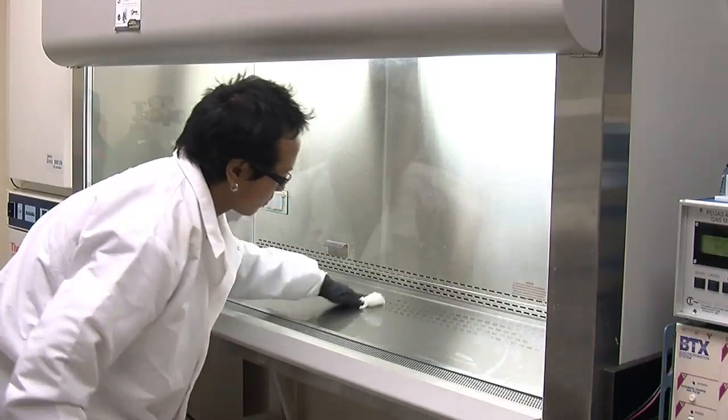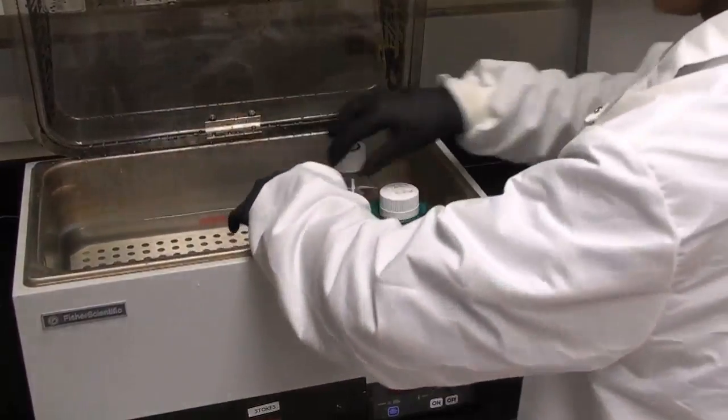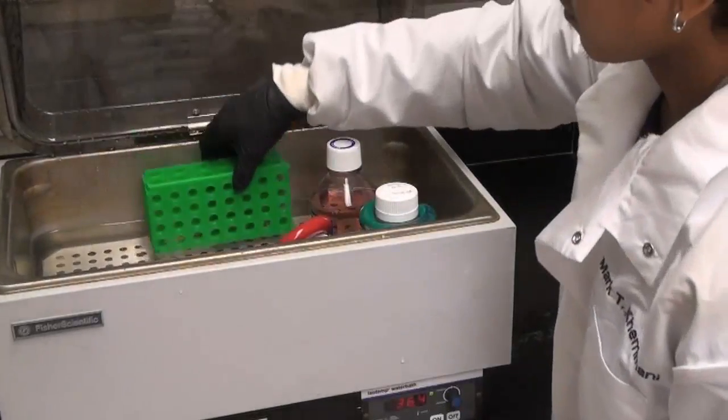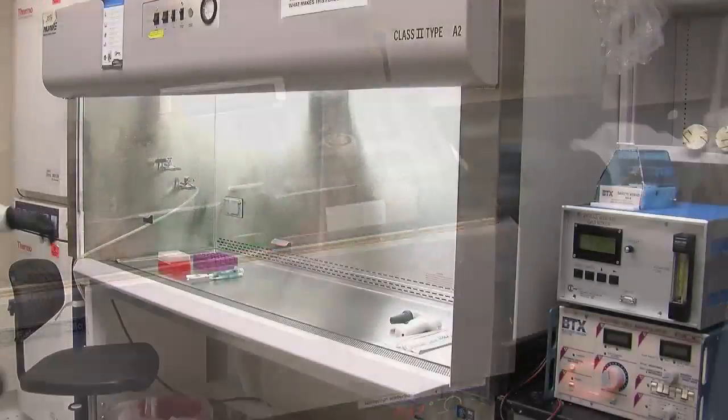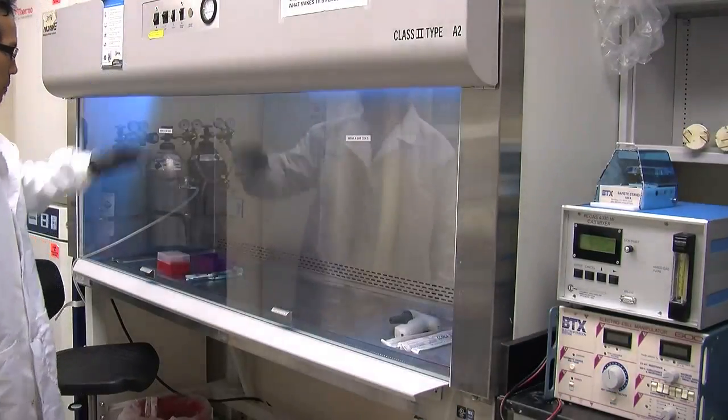While the antiseptic is doing its work, we can heat up our media. The media needs to warm up to 37 degrees Celsius. We let the media come up to the appropriate temperature, which usually takes about 15 minutes. One optional aseptic measure is to turn on the UV lamp while the media is warming up.